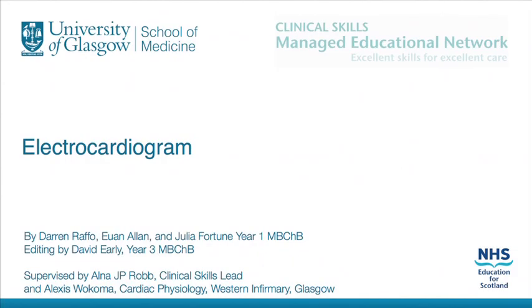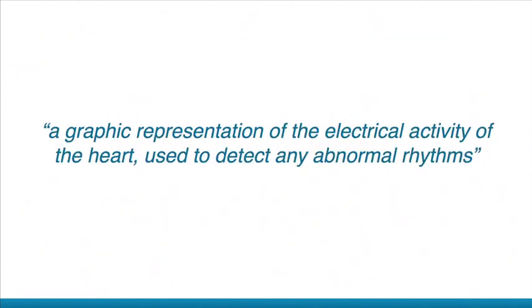Welcome to the Clinical Skills Podcast for Electrocardiogram. This podcast will cover the procedure of a routine ECG in an adult patient. ECG is the graphic representation of the electrical activity of the heart, used to detect abnormalities in rhythm and rate.